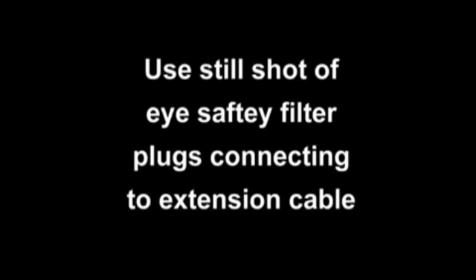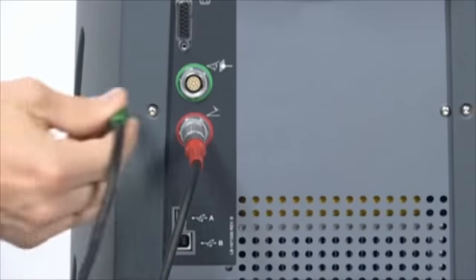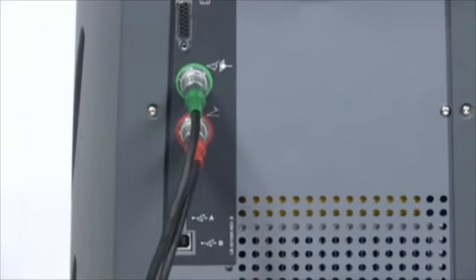When using one or two automatic eye safety filters, you must connect the eye safety filters to the laser console using the extension cable that was provided with your eye safety filters. To connect the eye safety filters to the laser, begin by inserting the eye safety filter plugs into the eye safety filter extension cable. Check the appropriate delivery device operator's manual for detailed instructions. Next, insert the extension cable plug onto the eye safety filter receptacle on the rear of the laser console.